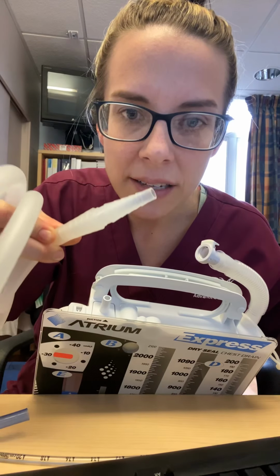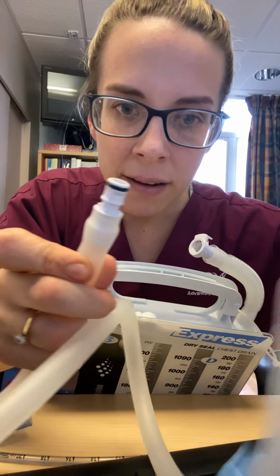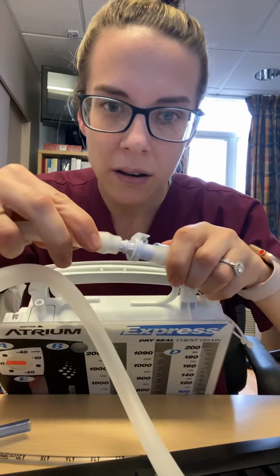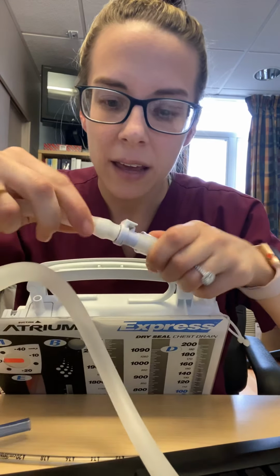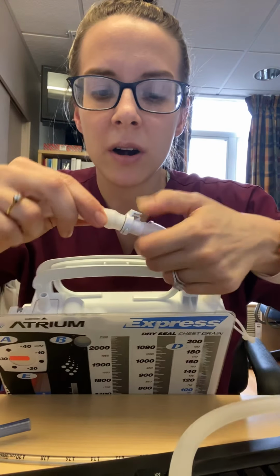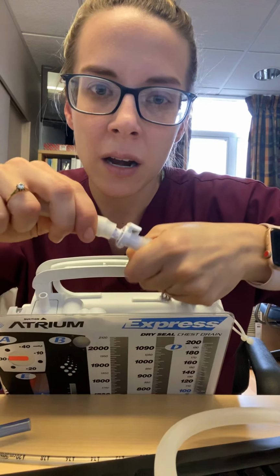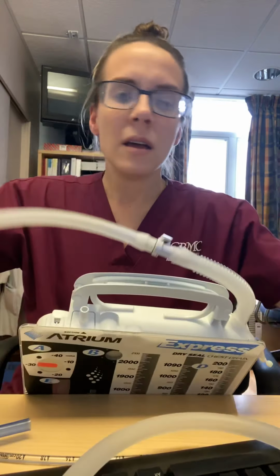And this will be what connects to the chest tube. So this end goes into this end. Click. So now you can tell it's together well. And then to get them apart, you press this button, pull it apart. Put it in, click.